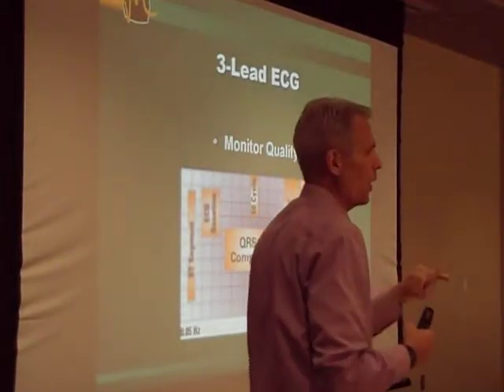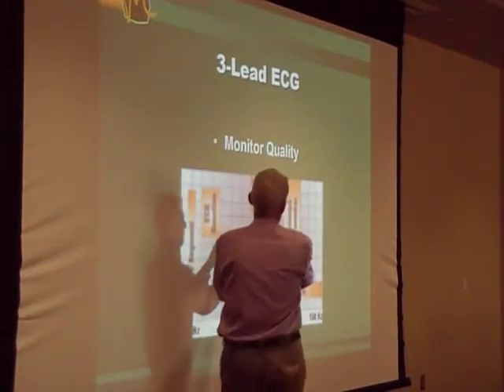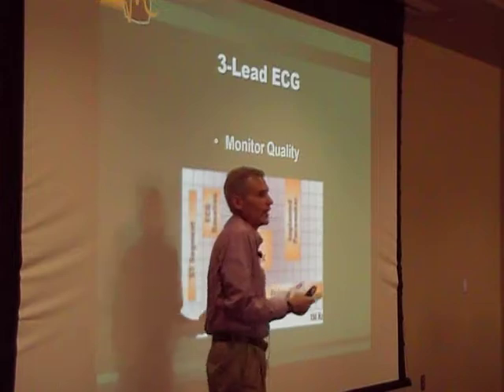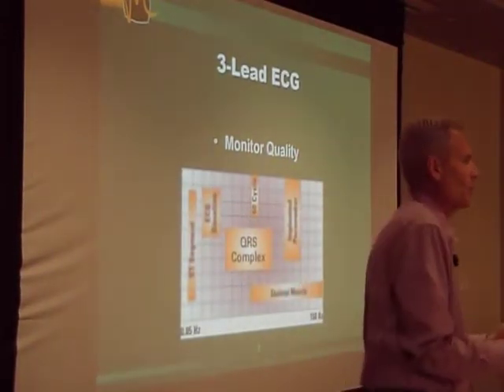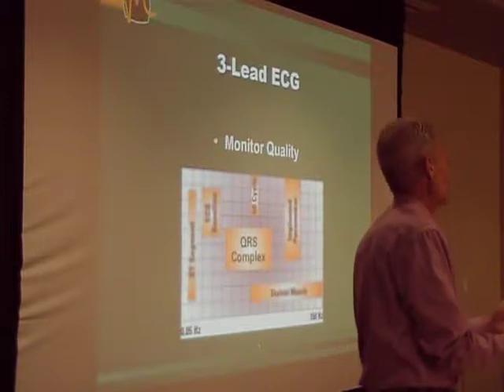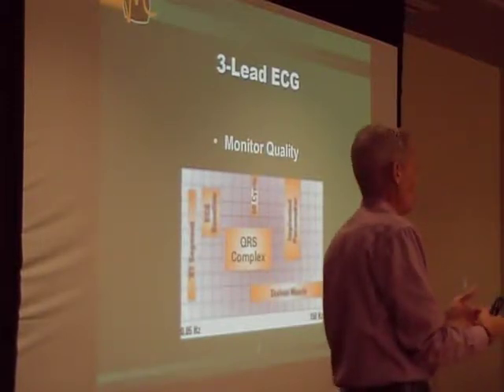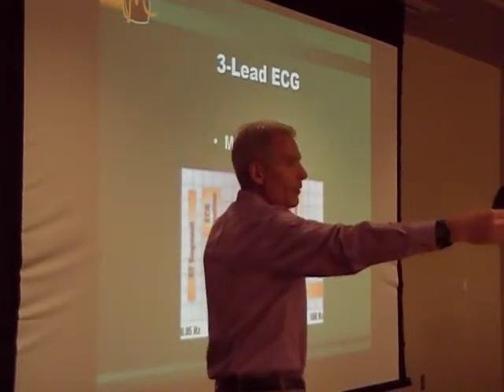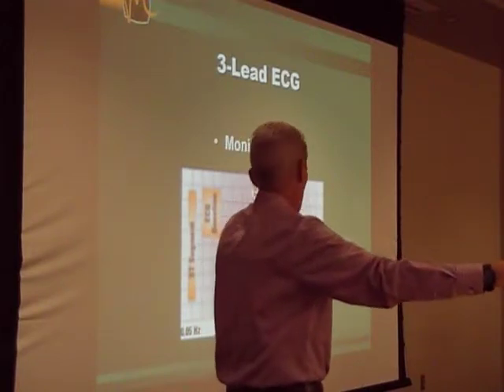So when you do a 12-lead on a patient, this window opens up and encompasses everything. And you probably already understand that when you acquire a 12-lead, it's very important to have your patient remain vitally still during that 10-second acquisition period. And that's the reason why. Because you've opened up the window to allow all that frequency to come in, and it may disrupt your EKG.